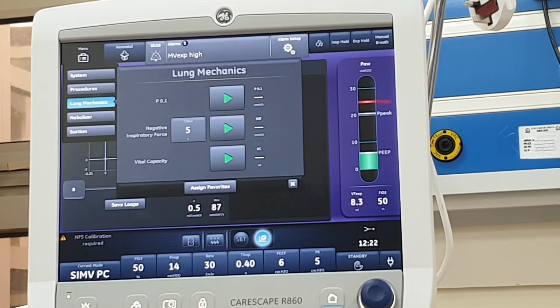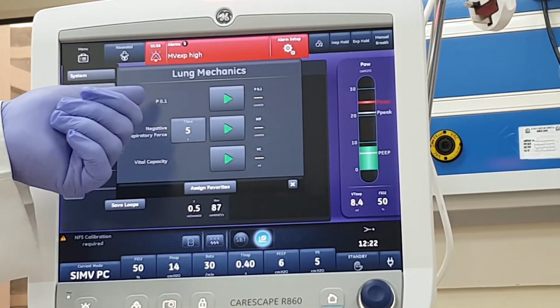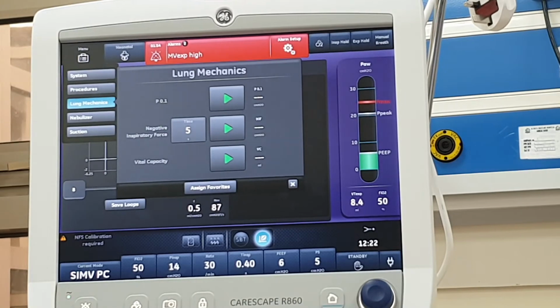Usually with head injury patients, they tend to have very rapid, deep and fast respiratory effort. Basically, P0.1 measures the first 0.1 seconds of the inspiratory time. If it's very strong, then a central issue is suspected. If it's not high, it should be around 0, then the patient is okay.